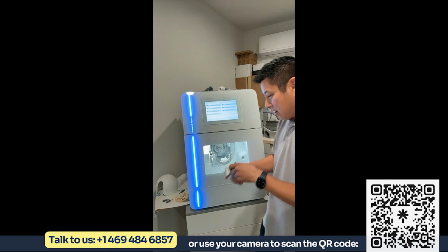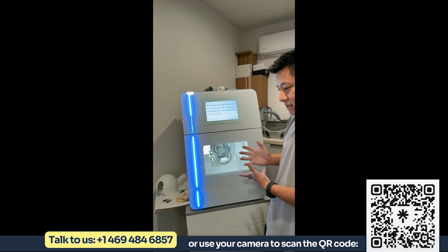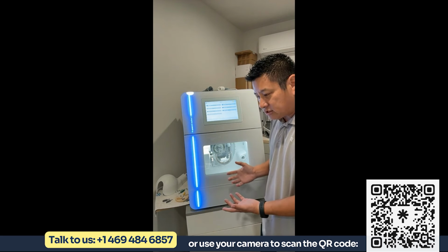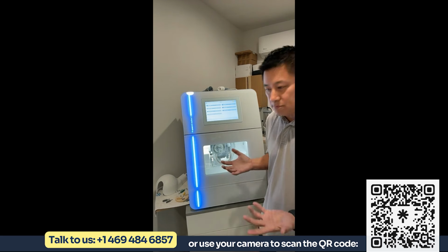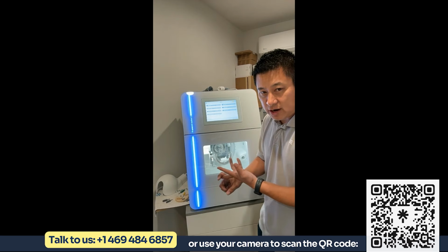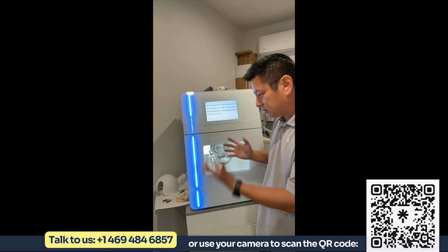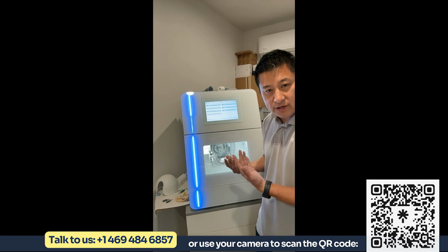Okay. Now, what that means is you're buying this mill for what it can mill today. You're also buying this mill for what it can do in 5 years from now, which I don't know what that is, but know that it's already 5-axis, it's already wet, it's already dry. If there's a new software or a new material that comes out that has to change, all we have to do is make a new arm and then the machine upgrades.